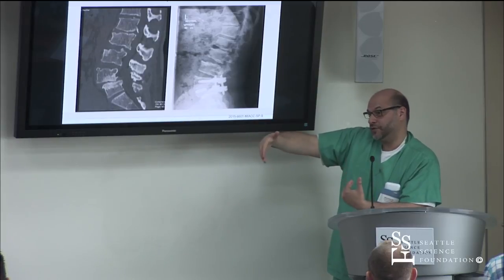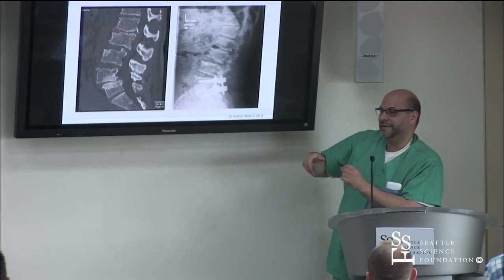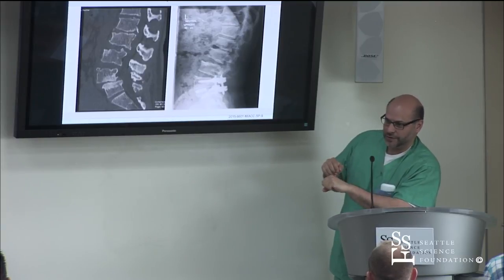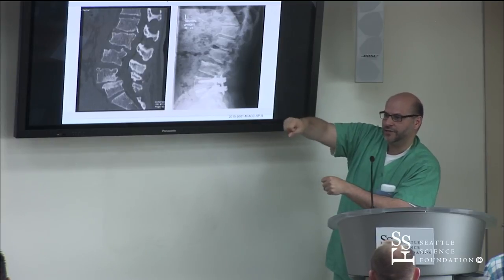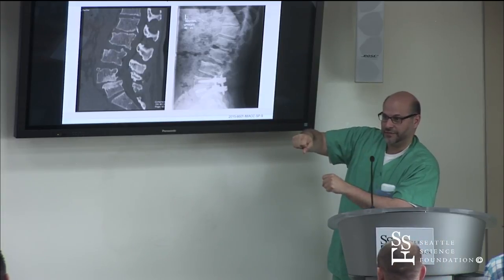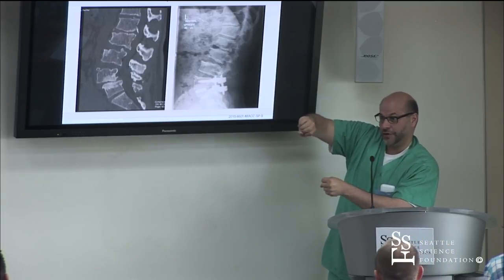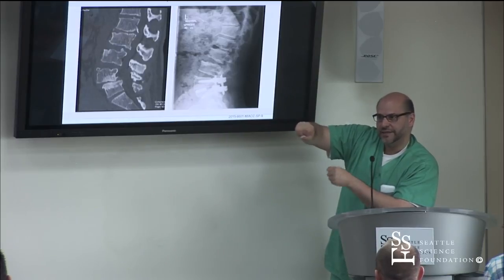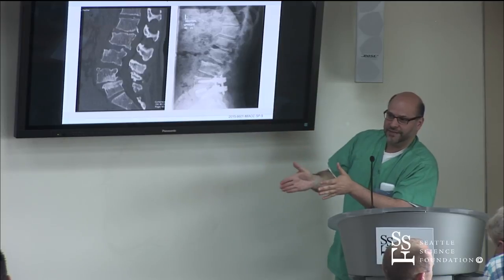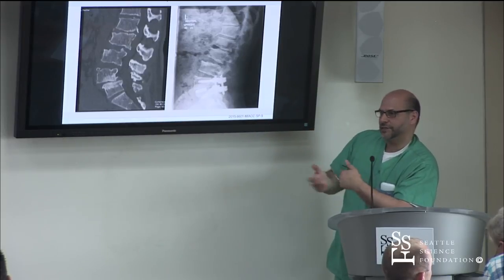Right, and now you've got both joints kind of down, and then you can get on your ipsilateral side with paddles, and you can start with the smallest, the 7 or 8, turn it, lock your superior screw set screw, take that paddle out, put in the next level, loosen your set screw, turn, lock, and you can do that sequentially. That way you're maintaining whatever distraction you get with the other side. And then you can do your interbody, your cage, and then your ipsilateral.